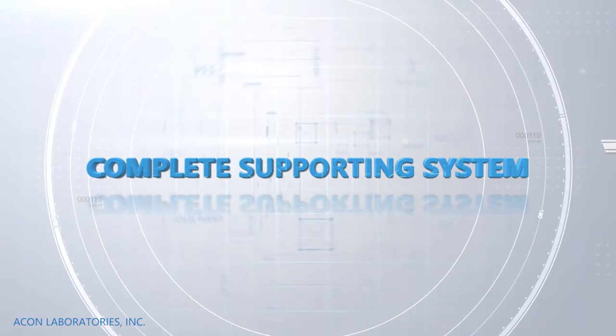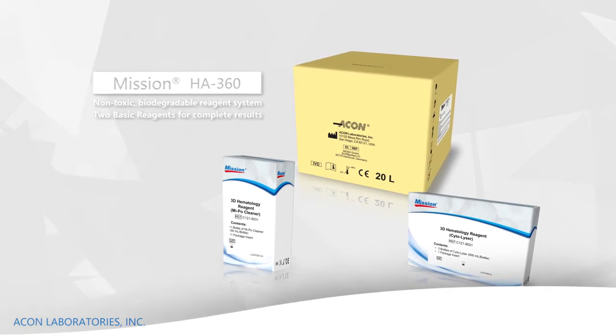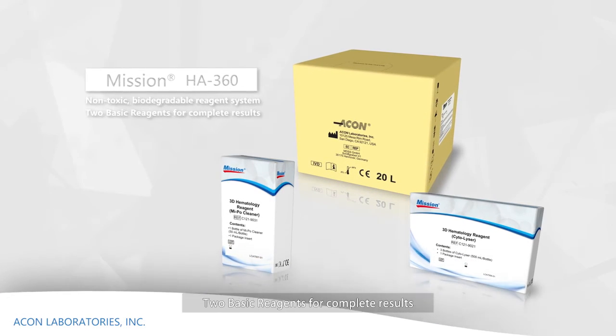Complete support system. Non-toxic biodegradable reagent system. Two basic reagents provide complete results.